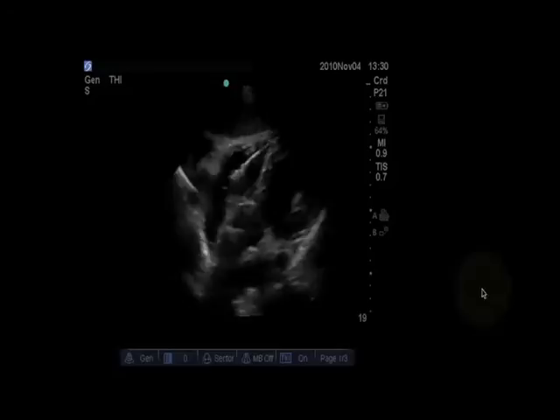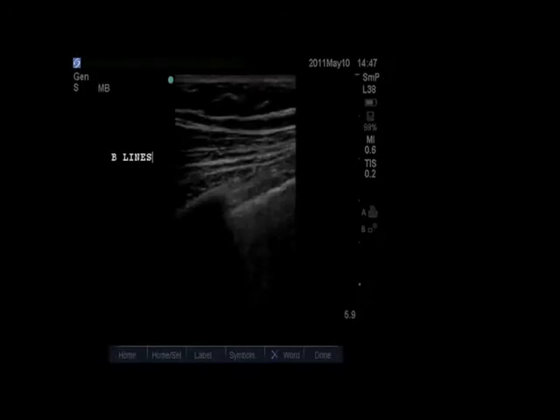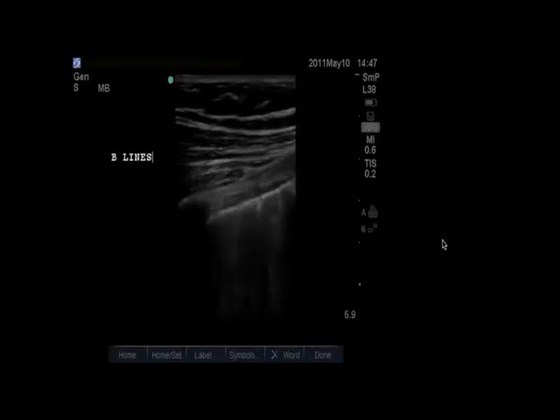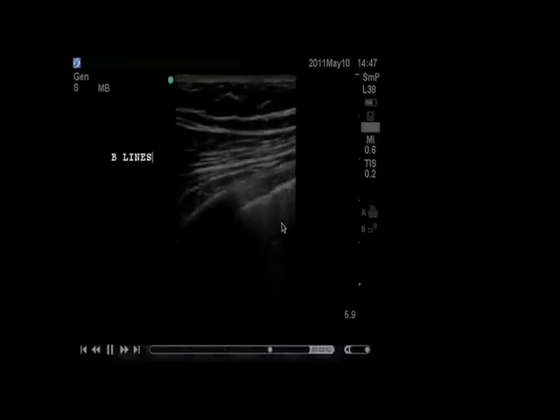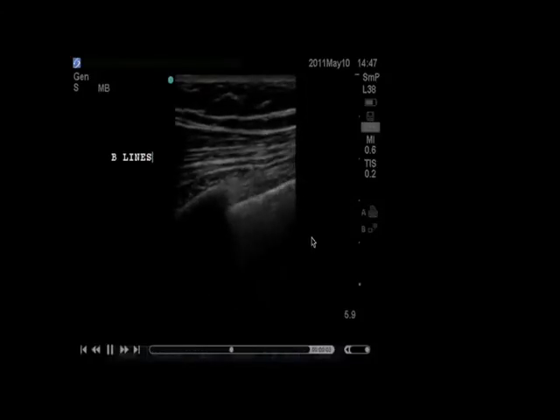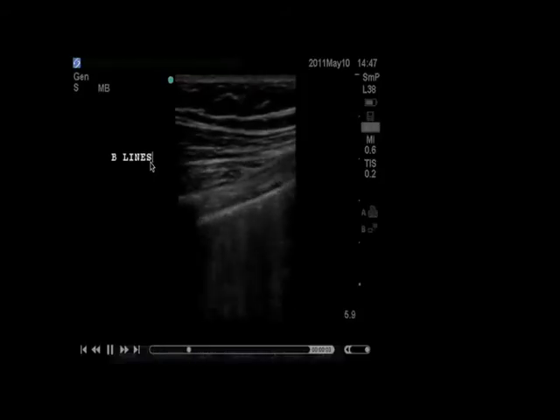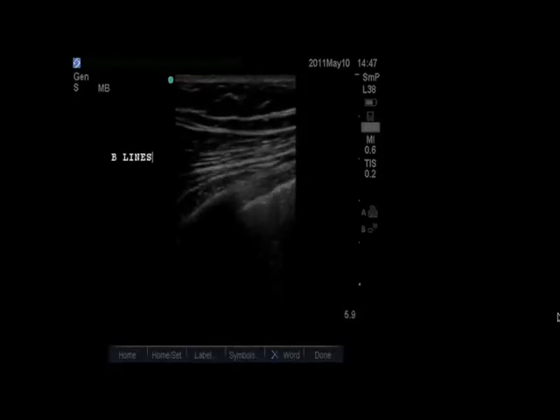For instance, in this image of a small pericardial effusion anteriorly, with no text on the screen, we have no idea whether you saw this or not. As a counterexample, we see this image of a pleural ultrasound with B lines extending from the pleural line, suggestive of congestive heart failure, and we see 'B lines' has been typed in on the screen. Let's see how this is done.